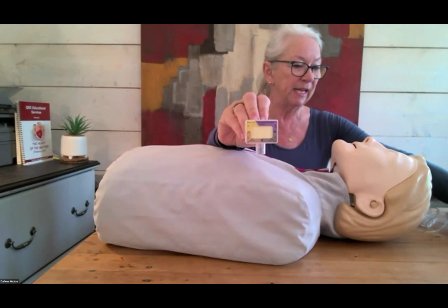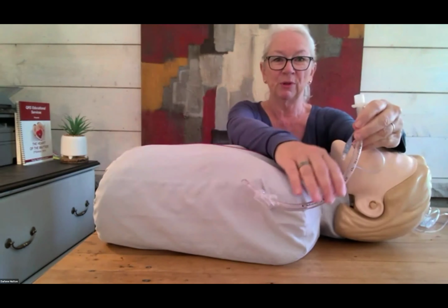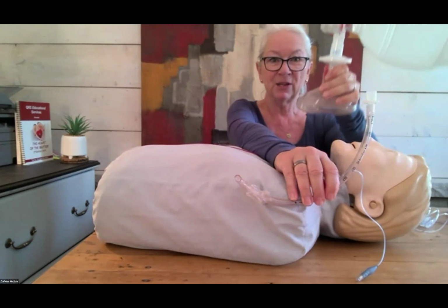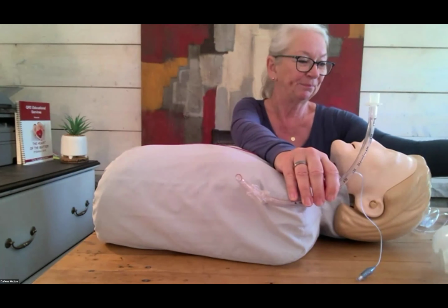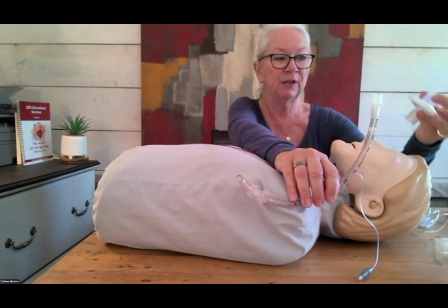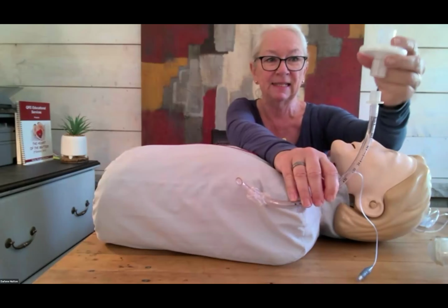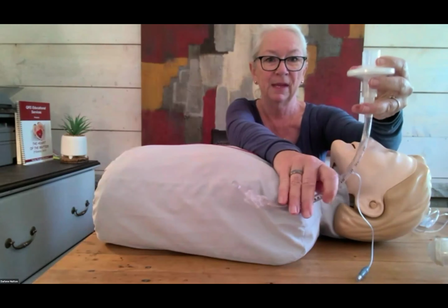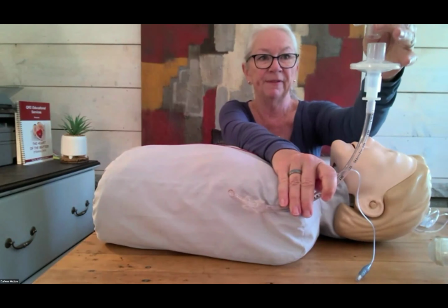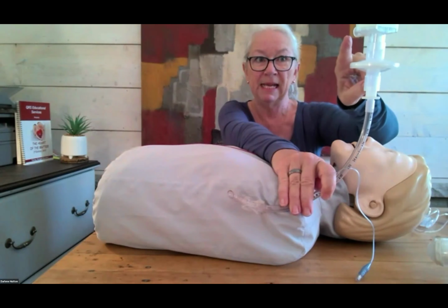Once the endotracheal tube is in place, kind of go through the motions here, we are going to take the mask off of our ambu bag. We are always going to have the filter next. And again, remember, there's no incorrect way to place this. Then we are going to place this device on top of the filter. And then we would attach our ambu bag here.